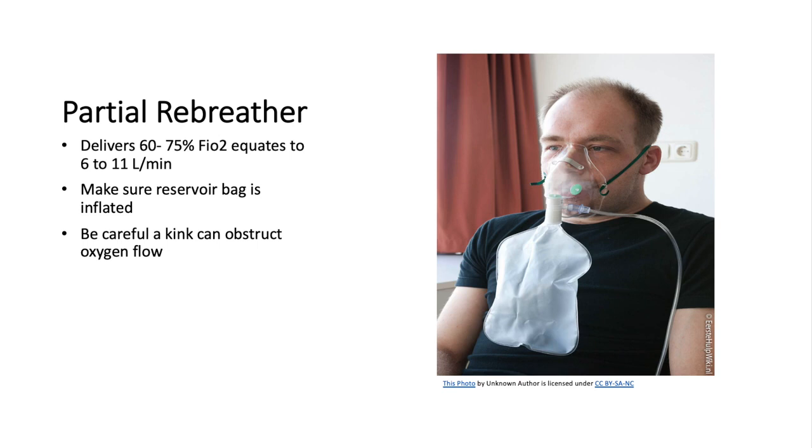So the setup includes a face mask that covers the nose and mouth of the patient and is inflated with a reservoir bag that has no flaps. So the patient will rebreathe 1/3 of exhaled tidal volume. With this, you want to always make sure the bag is inflated by adjusting the flow rate to meet the patient's oxygen demand. Also, this bag can kink and obstruct oxygen flow, so monitor and educate the patient.